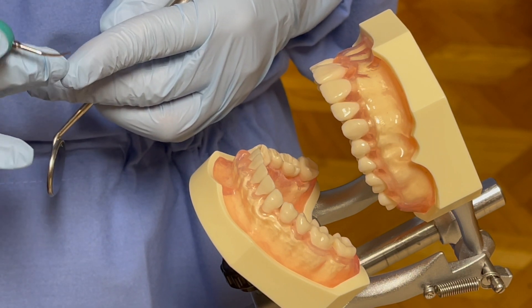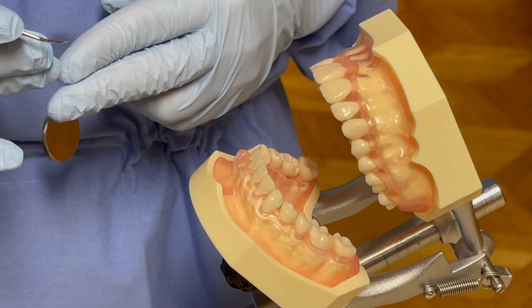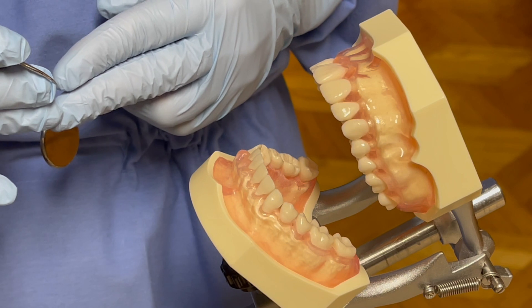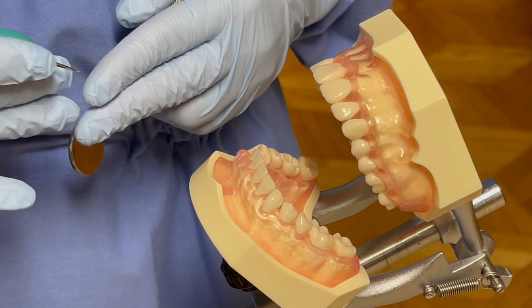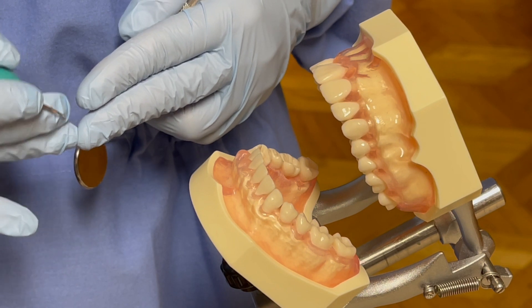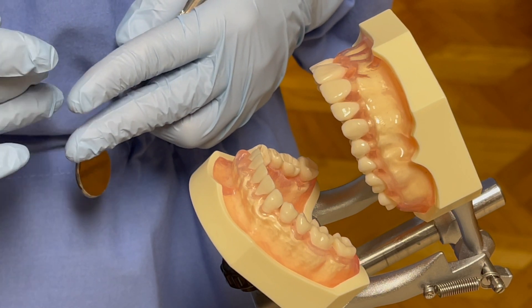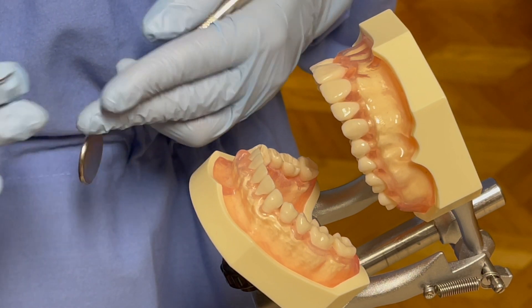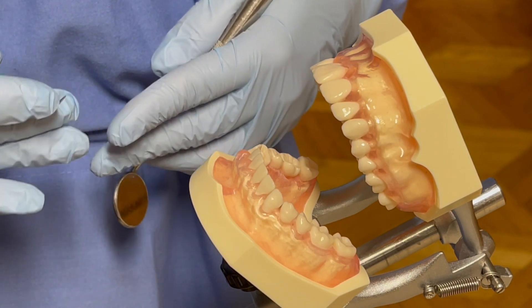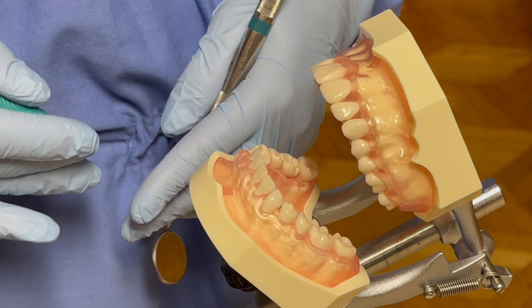You will feel the instrument moving around your teeth, you will hear a bit of high-pitched noise, and you will also feel some water mist coming out from the instrument. You are welcome to put on your headphones or earplugs if you like. I will use suction to reduce the water splatter as well as water pooling in the back of your mouth.